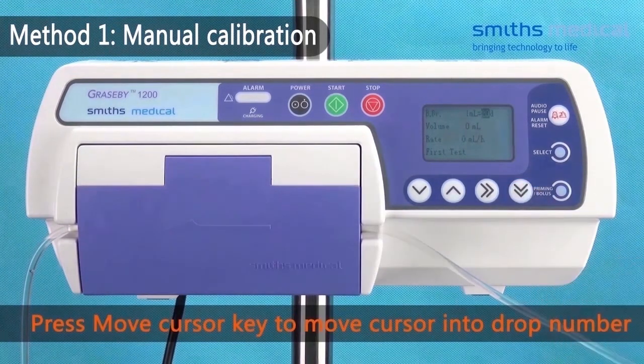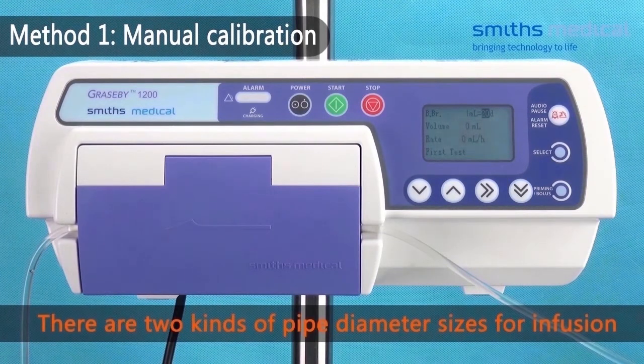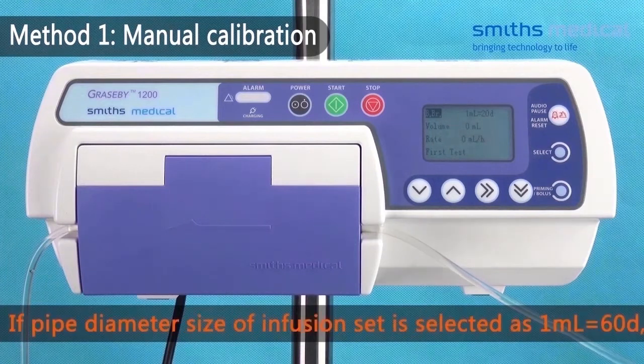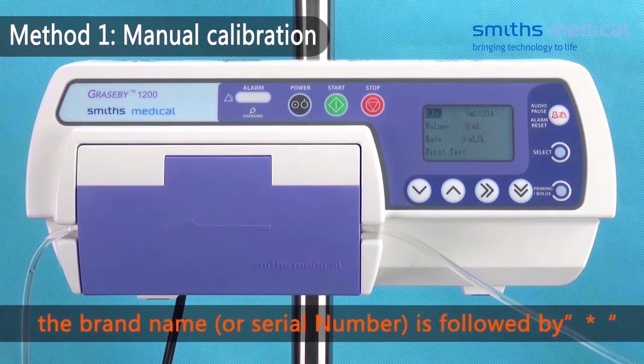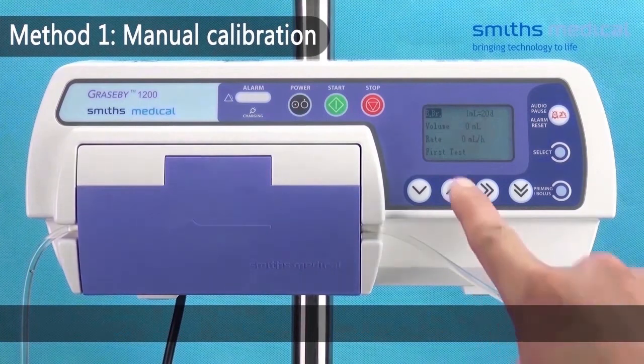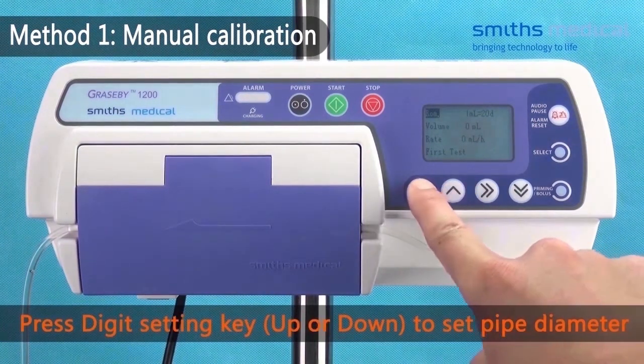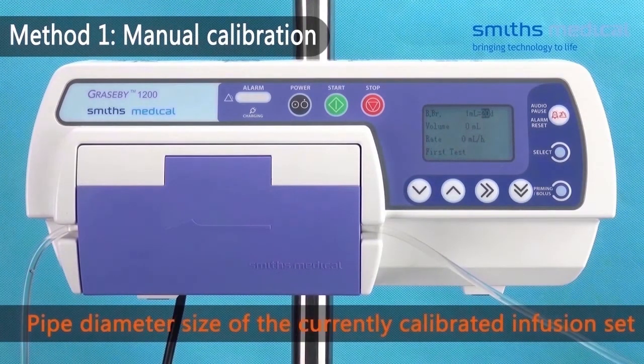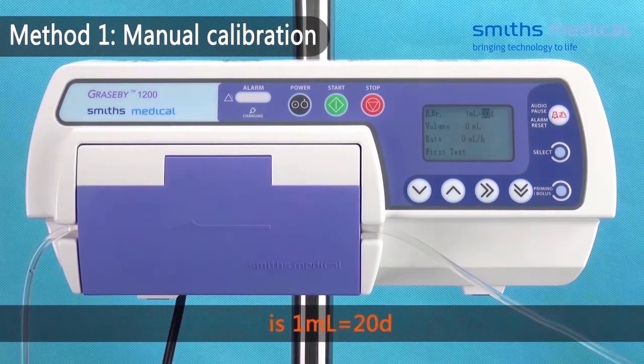Press the move cursor key to move the cursor to the drop number. There are two pipe diameter sizes for infusion sets: 1 mL equal to 20 drops, and 1 mL equal to 60 drops. If the pipe diameter size is selected as 1 mL equal to 60 drops, the brand name is followed by a star symbol. Press the digit setting key to set the pipe diameter size. The correctly calibrated infusion set uses 1 mL equal to 20 drops.